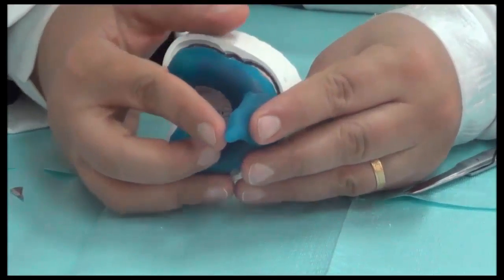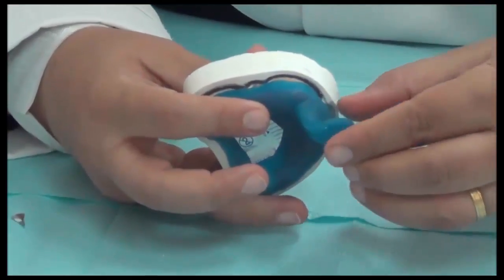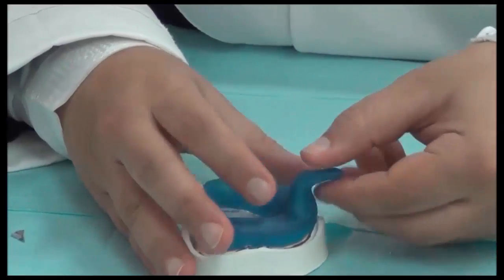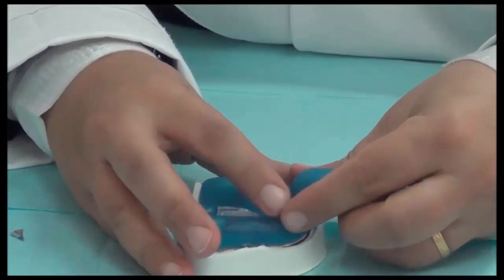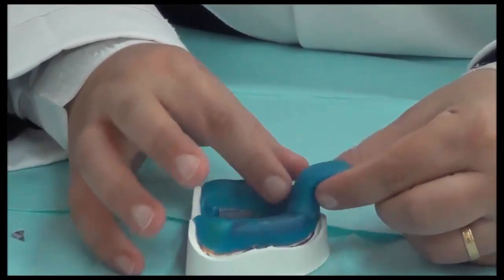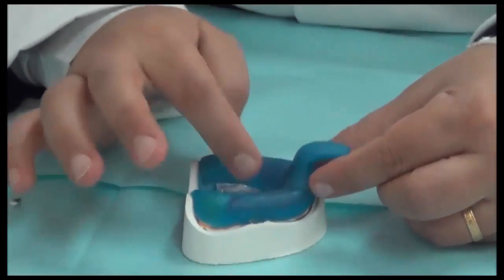And whatever is remaining, we just flip it to the side and flatten it to form the grip from which the dentist will be holding while we cure the material. So we have the body of the handle fused to the tray all around. We should not see any lines in between.